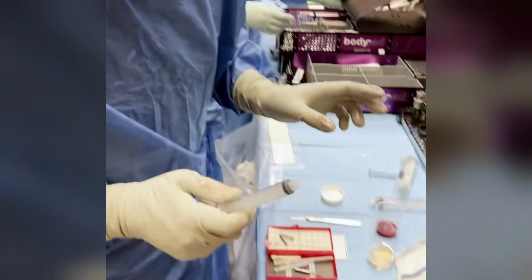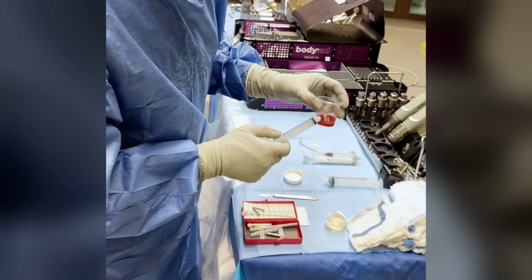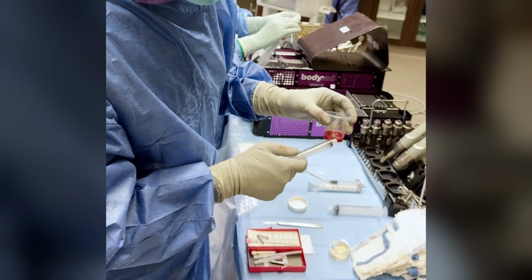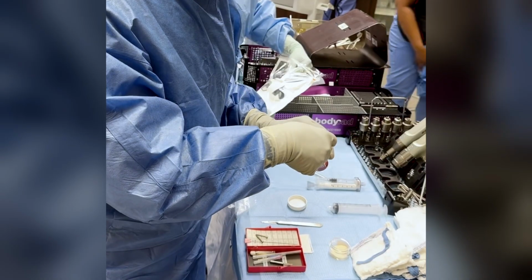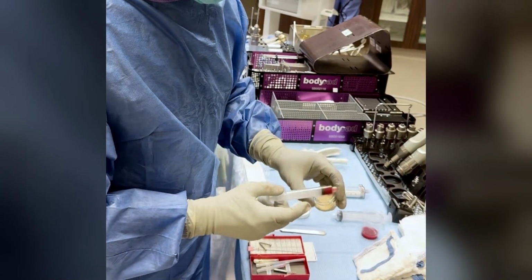Okay, so now we've got the bone graft for the osteotomy. What we've done is we've taken bone marrow from the patient's pelvis. That's been spun down to develop bone marrow aspirate concentrate. So these are the mesenchymal stem cells. We're gonna take some of these, and then this is bone substitute, demineralized bone matrix.